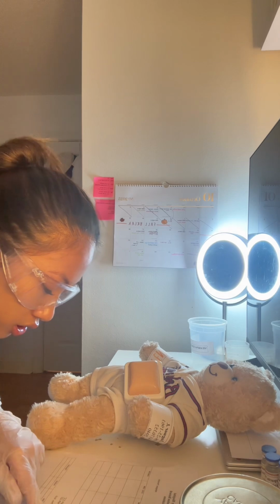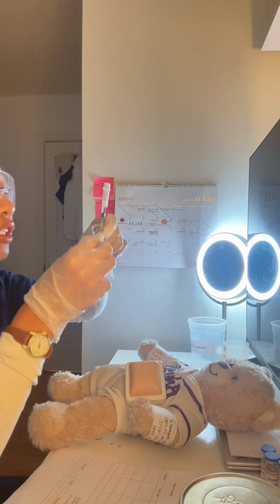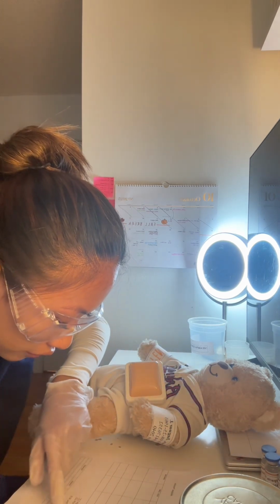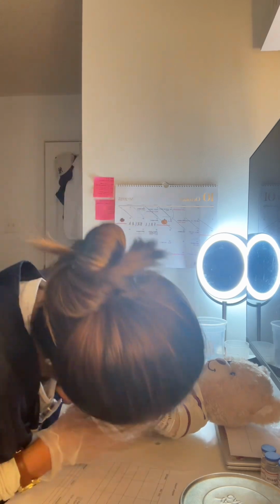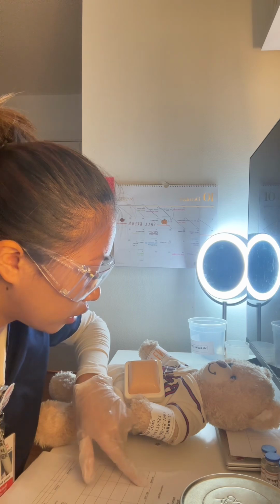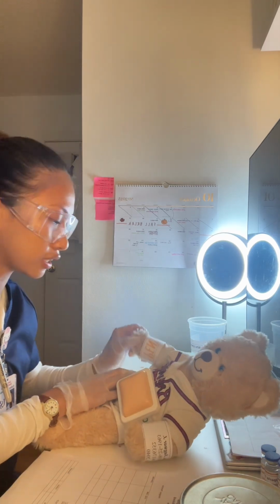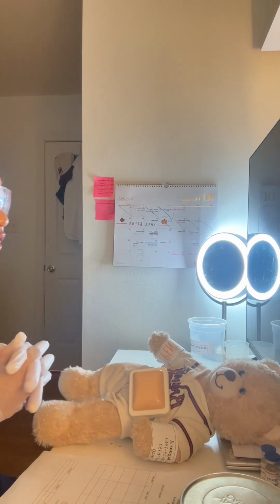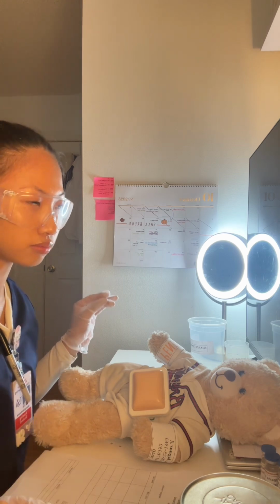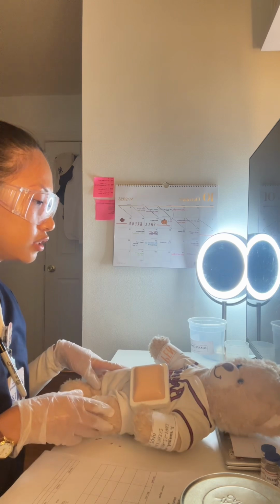So I have Jaguar J. Jones, and then this syringe here is for Jaguar J. Jones. And then I have MR numbers 4176352. MR numbers 4176352. Alright. You do have an allergy to penicillin noted, and I see on your wristband here you do have an allergy to penicillin. Alright, Mr. Jones, may I also ask, is there any other allergies that I should be aware of? Along with the penicillin? No, just the penicillin.